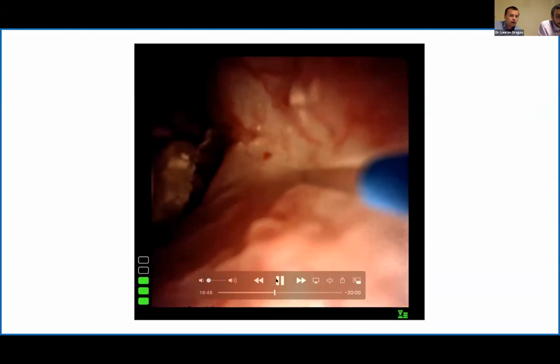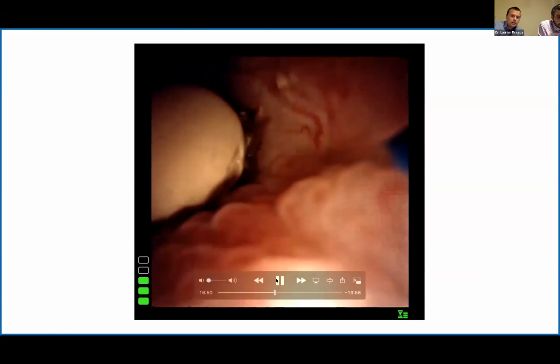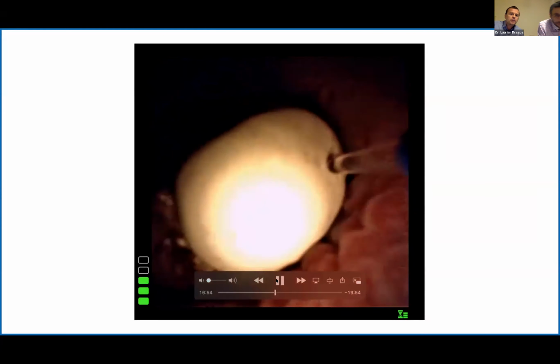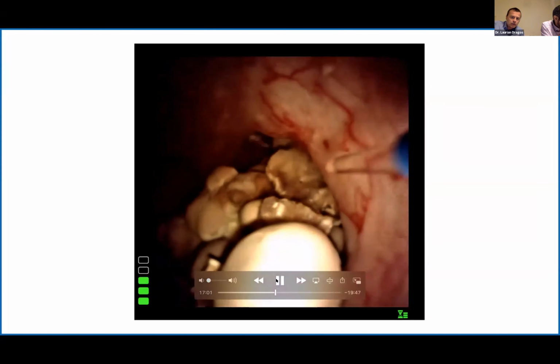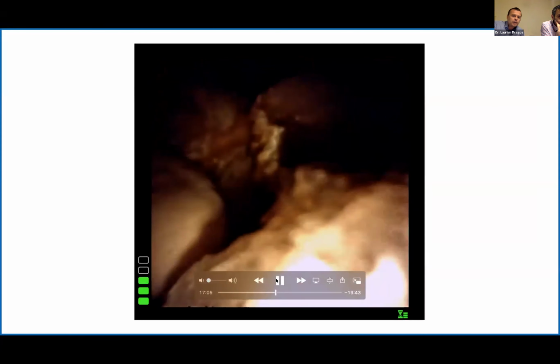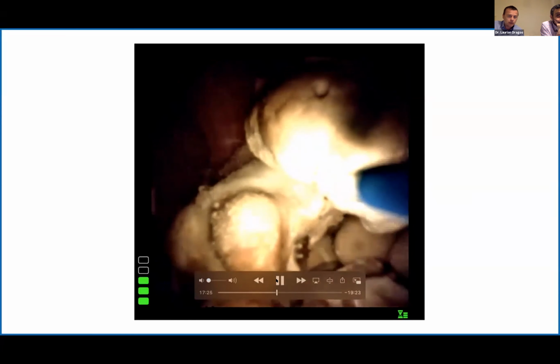It was due to the safety guide wire, which was down to the ureter, and it was really impairing my scope's movement. And here I was looking at my hands, and the fiber tip is touching the mucosa a lot. And you can easily just perforate or you have some bleeding. Obviously, it's not going to be significant bleeding. I did some there, but it can impair your image. And you see how there is a bit there. And then before starting, you see how difficult it is for me to get a proper position. I didn't understand at the very beginning that it was due to the safety wire. Anyway, the decision was to keep it in and to try to adapt and work with it going in the ureter.